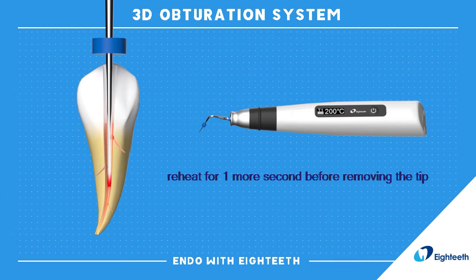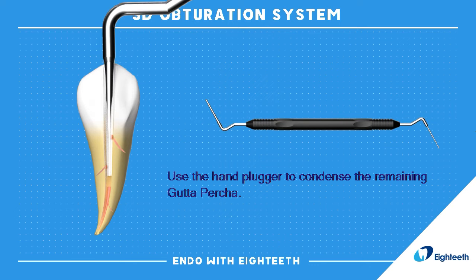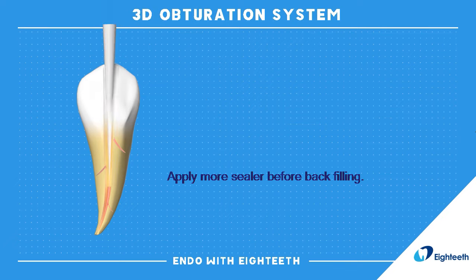Reheat for one more second before removing the tip. Use the hand plugger to condense the remaining gutta percha. Apply more sealer before backfilling.